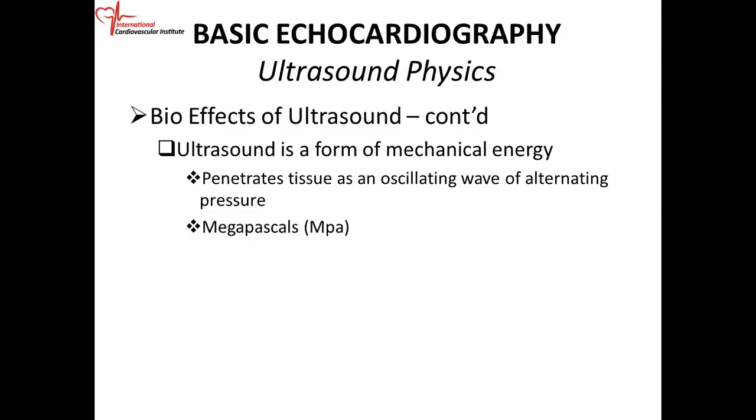So what you're doing there, you're harnessing the mechanical energy of ultrasound and breaking up these stones. So when you do that, you're using much more energy than what we would use in a diagnostic ultrasound test. Okay, so ultrasound is a form of mechanical energy. It penetrates tissues as an oscillating wave of alternating pressure. So you have a large.